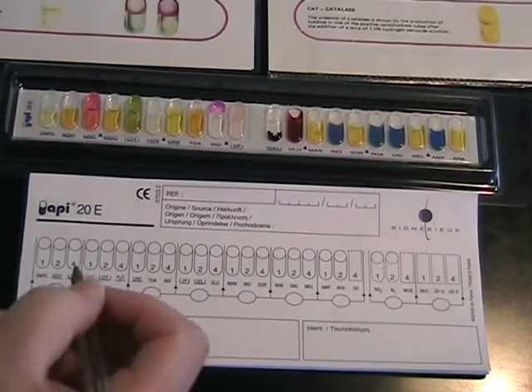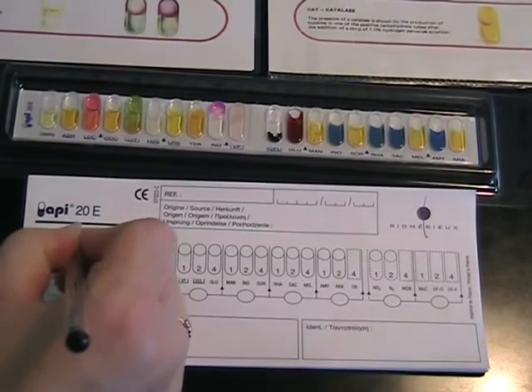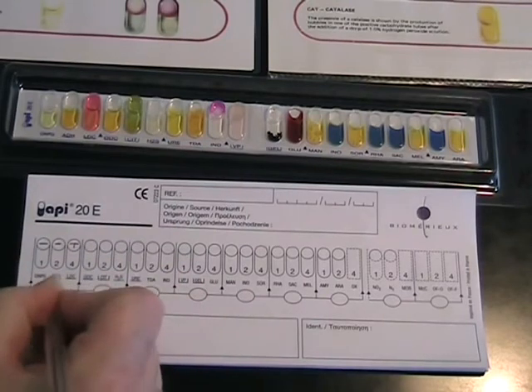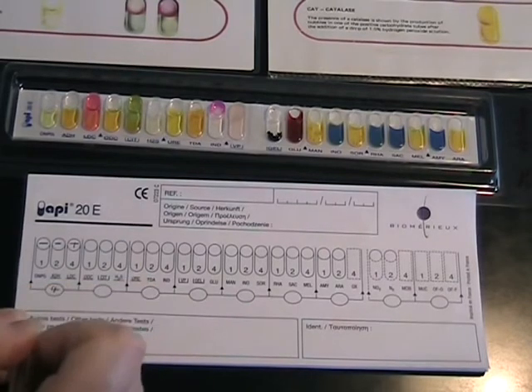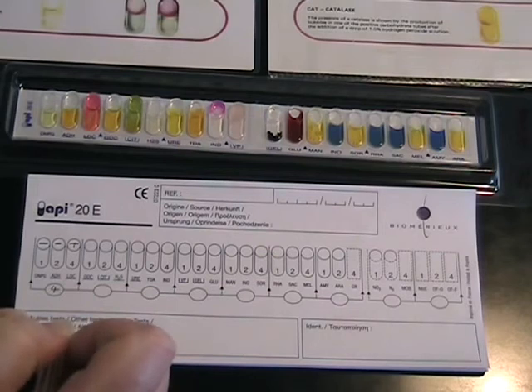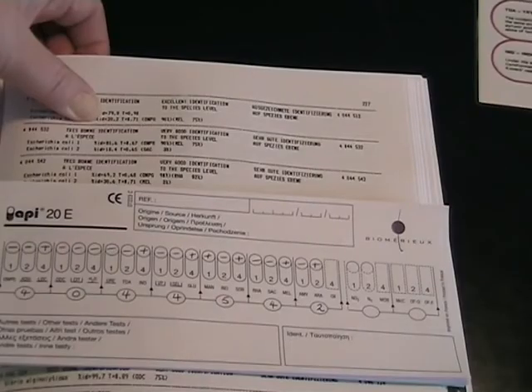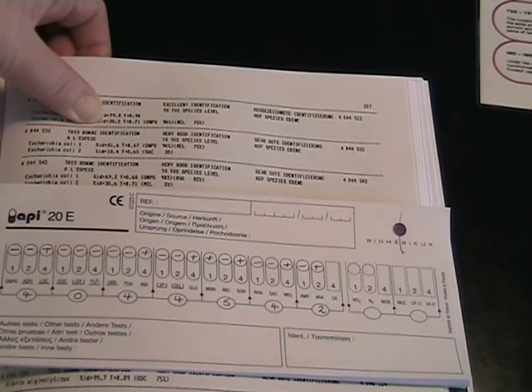The first test result would be negative. The second one is negative. The third one is positive — so for that 3, it gives you a score of 4. So the first number in your numerical sequence will be 4. We continue across the page until we generate this 7 figure number. We've generated a 7 figure number which we've looked up in the book, and it shows you we have a very good identification to species level for E. coli.